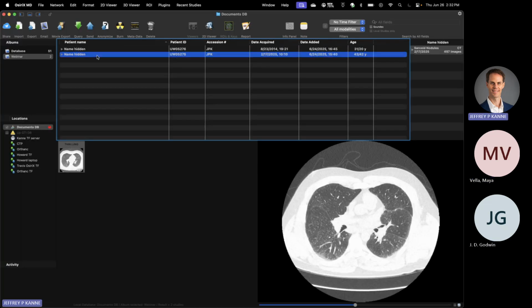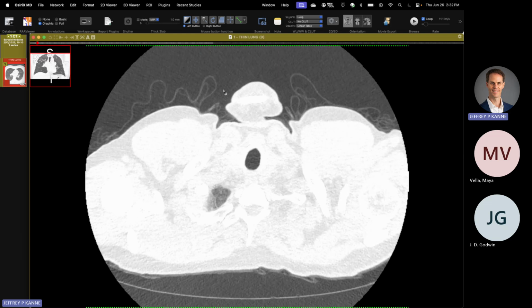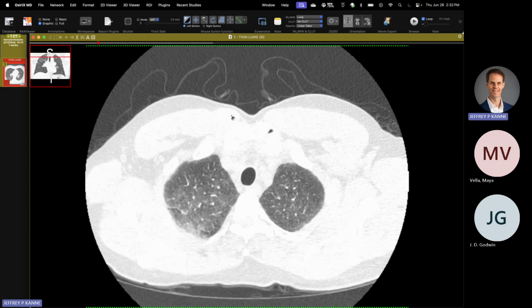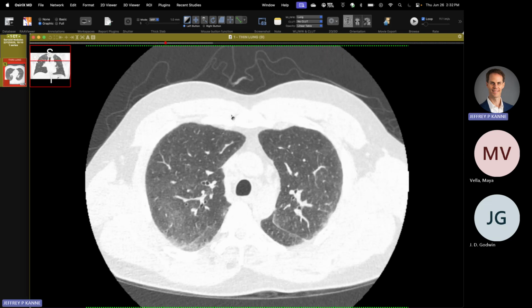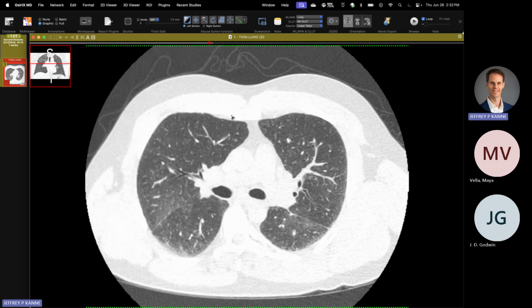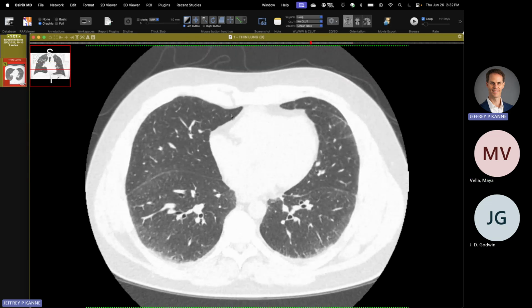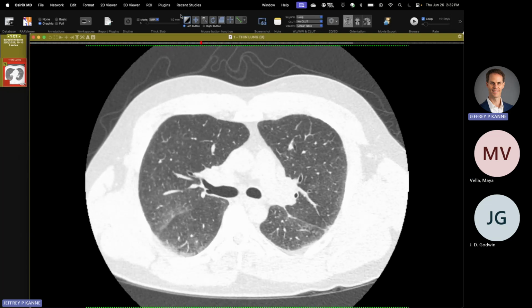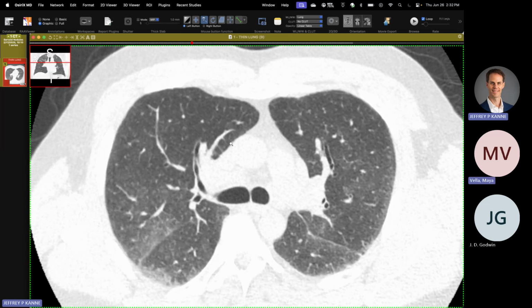Nice. And then this is a fun case. I don't think the diagnosis is in question for people, but especially if you're new to this or you're less experienced, this is a good pitfall case. So if you look at this patient, they're short of breath. And so we did a CT scan, outpatient. And at initial glance, you might say, well, there's some ground glass opacity, which I guess technically there is, but you have to look carefully. And one of the things I always harp on my residents is when they're taking cases is they scroll too quickly and they miss subtle things.